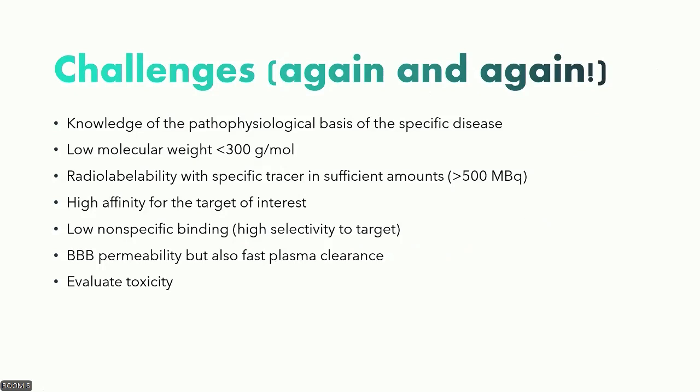In the case of neurological disorders, the key thing, as I showed you before, is you have to know what you're looking for in the brain. You're looking for abnormal accumulation of a protein. You're looking for depletion, for the death of some specific neurons, and so the lack of neurotransmitter those neurons produce. But the point is, many neurological disorders do not have a clear pathophysiological basis, or many of them share pathophysiological mechanisms. Think at the dementias, the different forms of dementia. Some of them overlap with movement disorders. So you have a spectrum of diseases that might have the same PET abnormalities, depending on the tracer. And then I don't know what I have to cure, basically. I don't know where my drug needs to act. I'm not sure of what is the target of my drug.